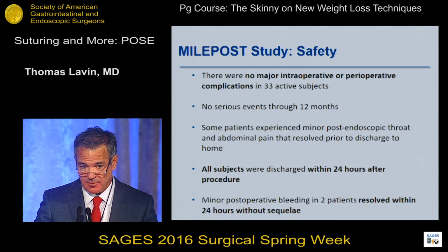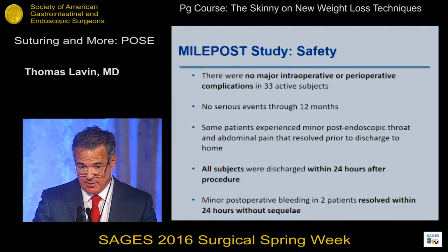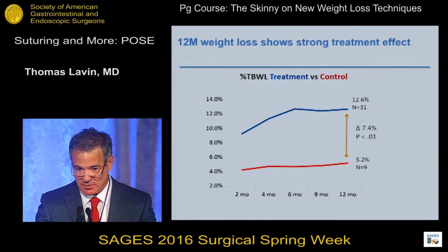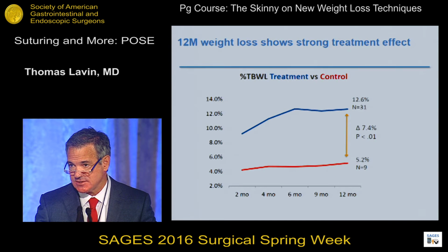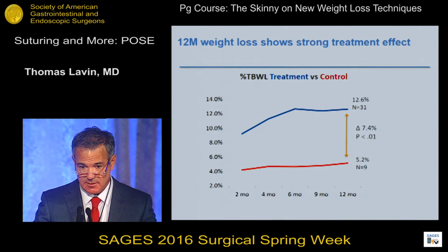No major intraoperative or perioperative complications. Mild throat pain, which we pretty much see, throat pain and mild nausea, in most of the patients. There were two post-op bleeds that resolved within 24 hours without sequelae. And here are the weight loss results over the first 12 months, with a strong delta of 7.4 between the exercise and diet arm and the active arm, and 12.6 total body weight loss, which is impressive.